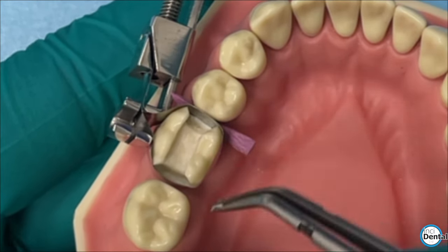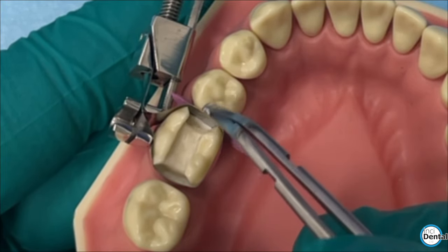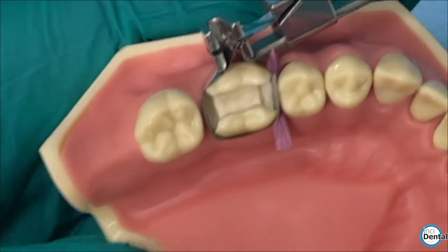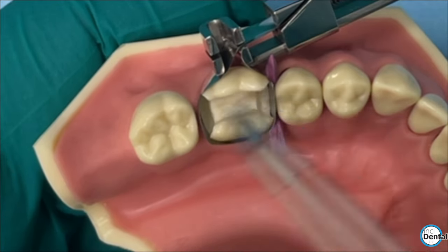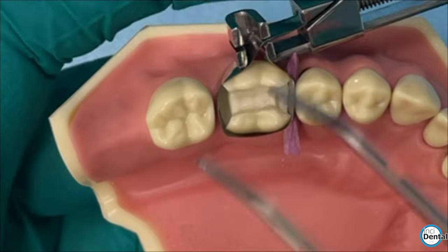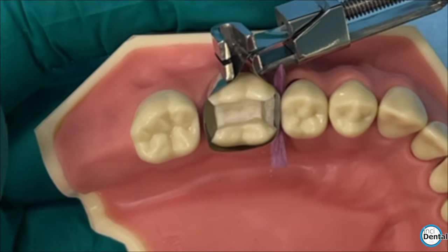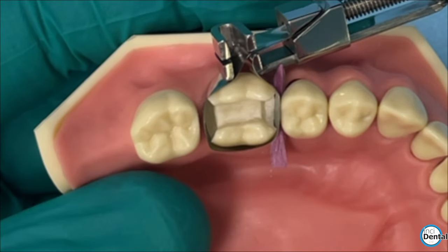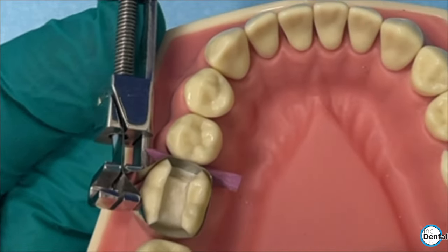It's always difficult doing mesial and distal with a circumferential retainer like this. You can get one side right, but the other side will lift up. So it's always preferred to do one contact at a time. But that's the rationale for these curved bands. I know they're very popular in plastic retainers, but if you can use them in a Toffermeyer, you're going to save a lot of money, it's better for the environment, and they're really easy to use.